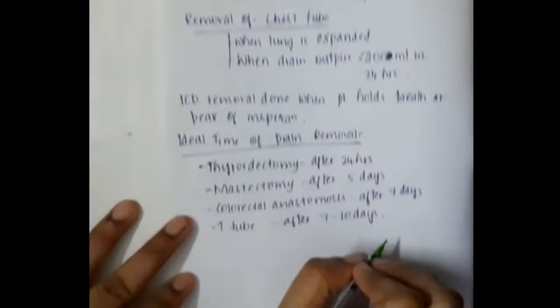So this is about the intercostal drainage tube insertion.